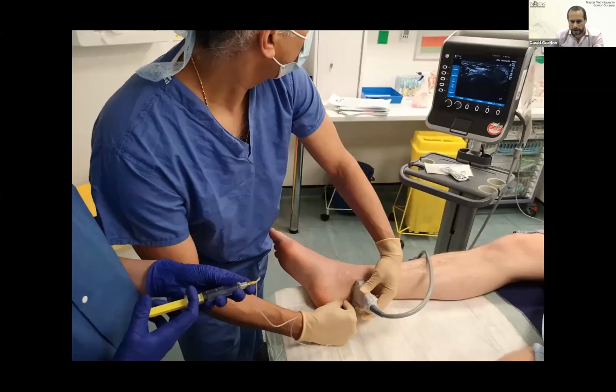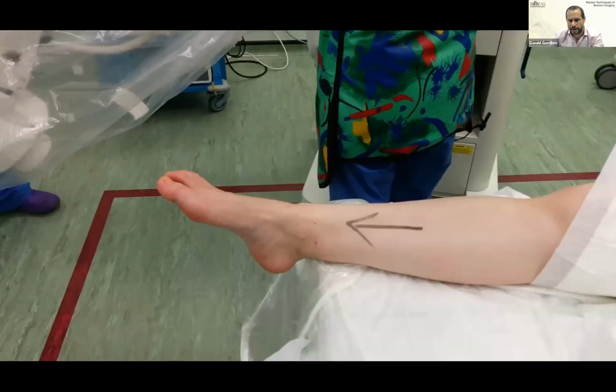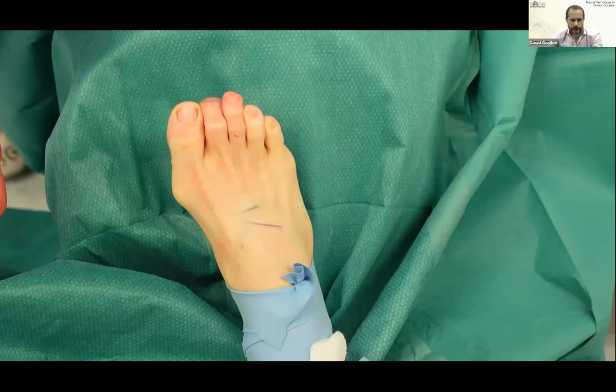All my surgeries are performed under ankle block, and most patients have some light sedation. Some patients are awake, and some patients have a deeper sedation. You need intraoperative X-ray throughout, either a mini C-arm or an image intensifier. Certainly it's easier with a mini C-arm that you can move and control yourself. And the patient's positioned with the foot dangling off the end of the bed, so you can get your image intensifier underneath and get a good shot of the foot. Typical bunion deformity, a moderate deformity here, and I'll talk you through the steps in order to correct it.